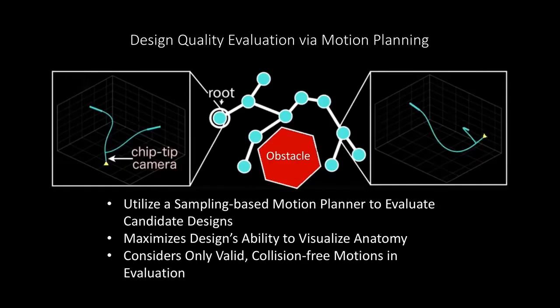optimal design. In order to evaluate the quality of a design sampled by ASA, we leverage a sampling-based motion planner. We keep track of the points on the interior surface of the anatomy which are visualized at each step of motion planning. This allows us to consider the capabilities of a design to visualize the anatomy via collision-free motions.